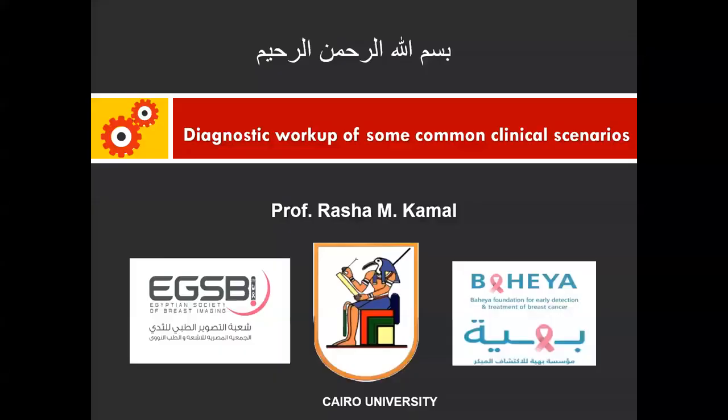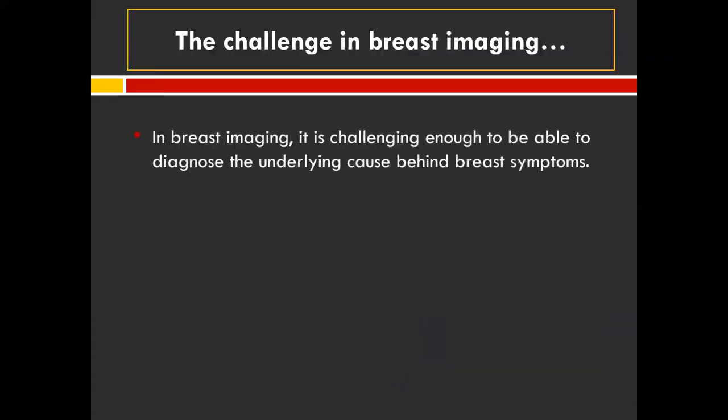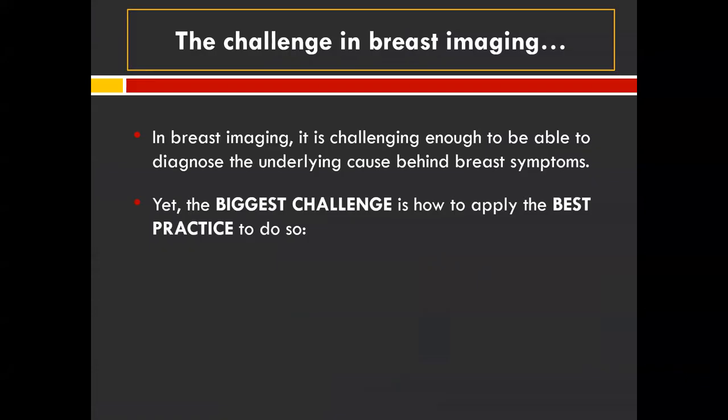Good morning, dear colleagues. My first topic today will be the diagnostic workup of some common clinical scenarios. In breast imaging, it is challenging enough to be able to diagnose the underlying cause behind breast symptoms. Yet the biggest challenge is how to apply the best practice to do so.